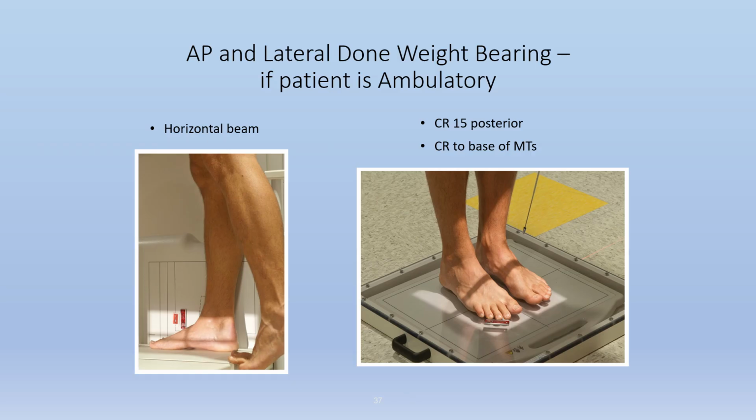We talked about the fact that if the patient is ambulatory, ideally they are done weight-bearing. So the AP and the lateral are typically done weight-bearing if they are walkie-talkie. If it's a trauma patient and they're not able to stand, then we are not going to stand them to do these images. Okay, these are actually on 235 and 236.